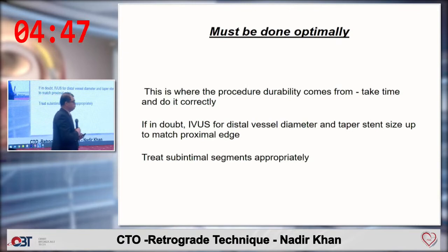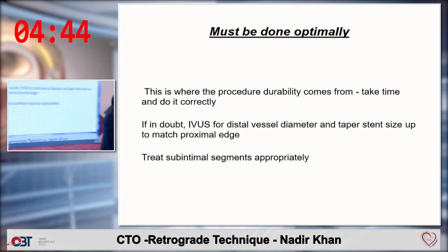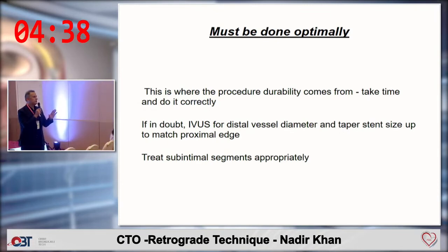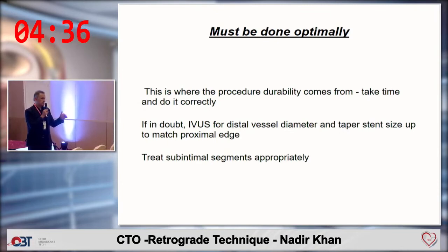And for the snaring, first of all, we should never use 014 long wire. In the market, we have 014 300-centimeter wires; Fielder has it, and Pilot has it. We never use them. Never use 014 wire for externalization. We always have to use 010 wires. This is a very important point. If you use them, you will definitely have a serious problem. Please don't use them.